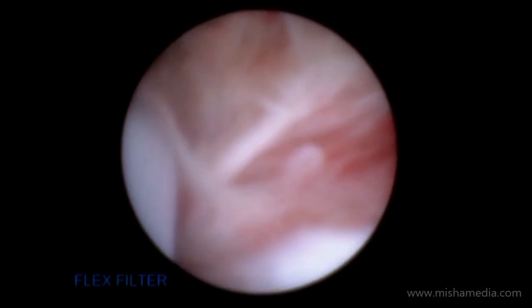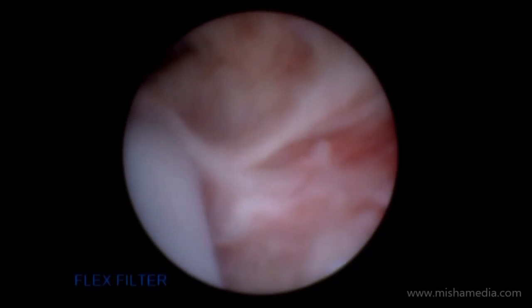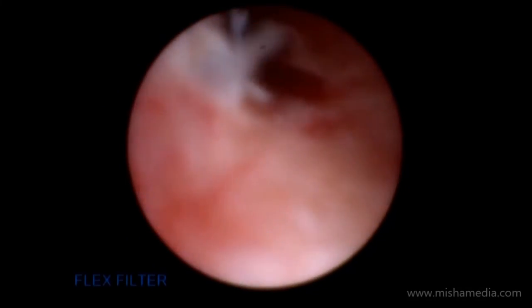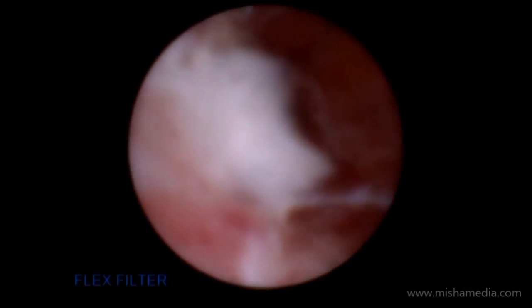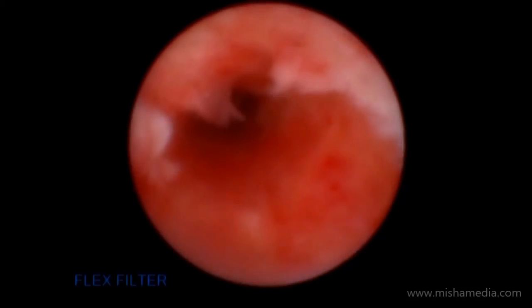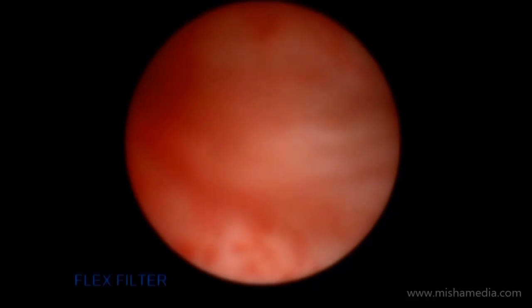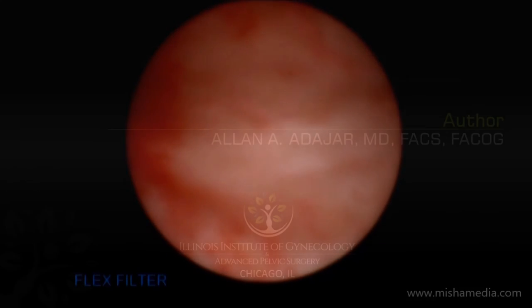After advancing the guide wire into the uterine cavity, the vessel dilator is then threaded over the guide wire through the endocervical canal and into the uterine cavity. Resolution of the false passage is demonstrated using hydrodilation to pass the hysteroscope into the uterine cavity.